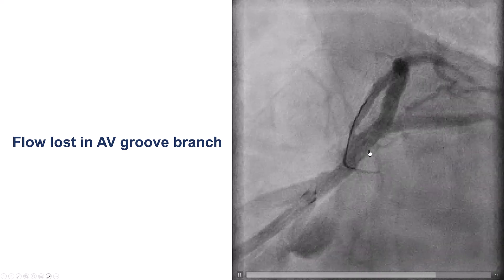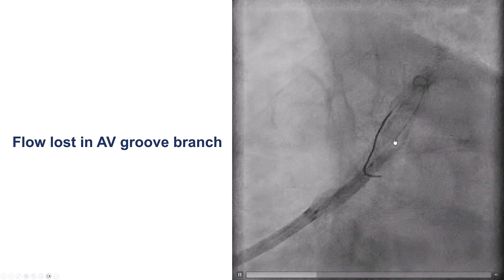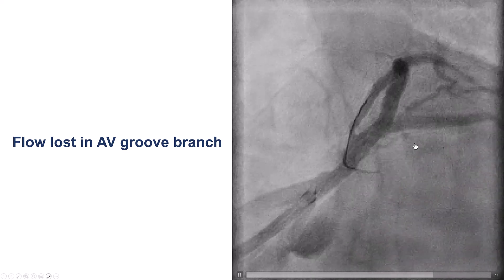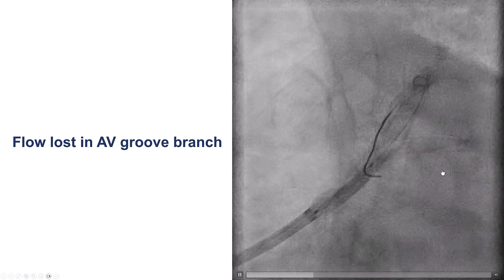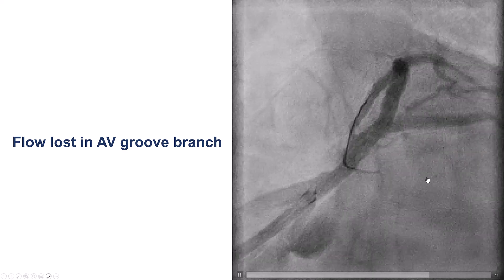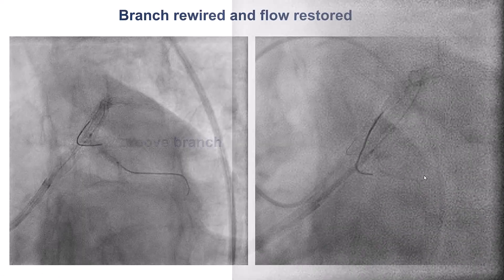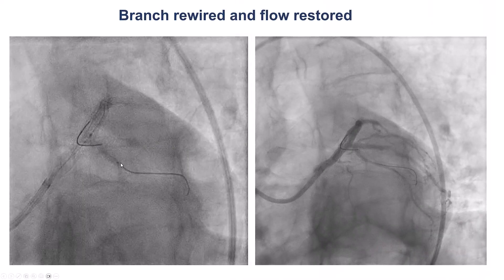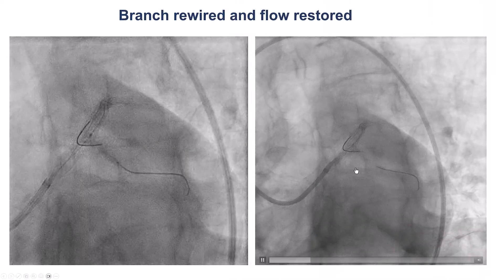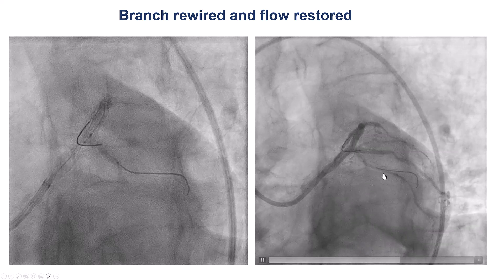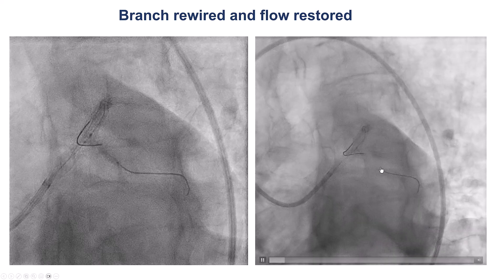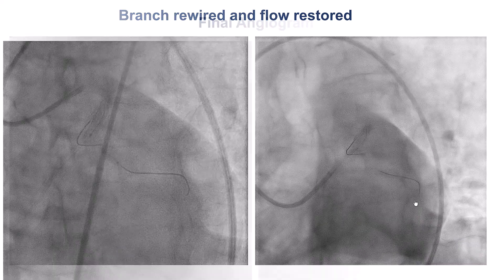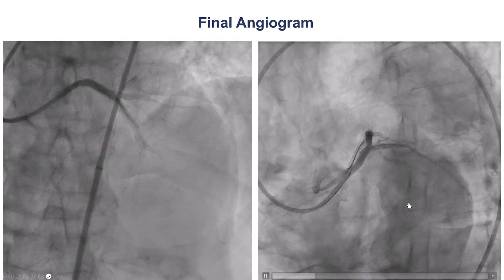After doing this, we unfortunately had loss of flow into the more distal circumflex. Fortunately, we were able to wire it with a workhorse guide wire, perform balloon angioplasty, and restore antegrade flow into that vessel.